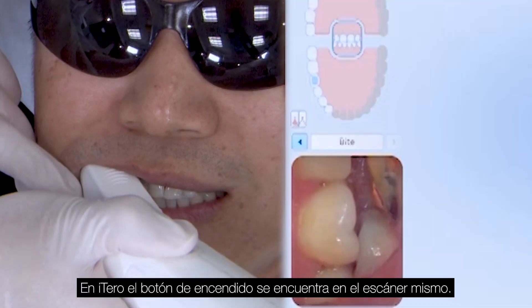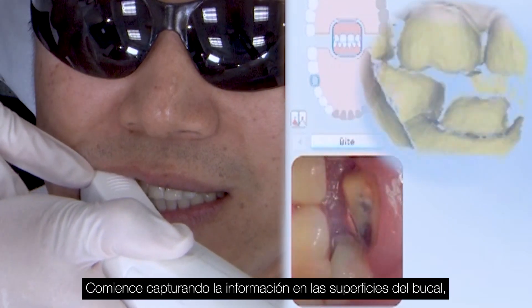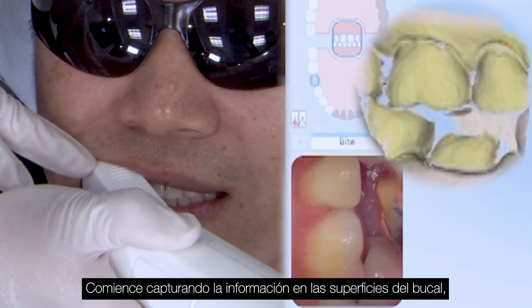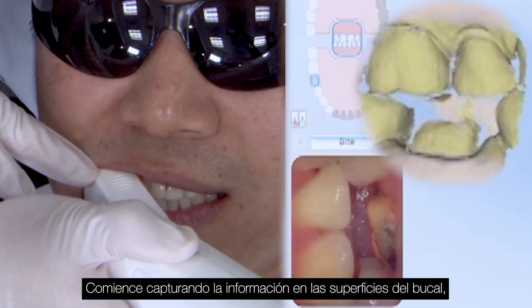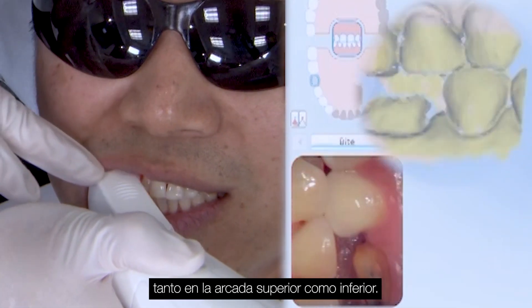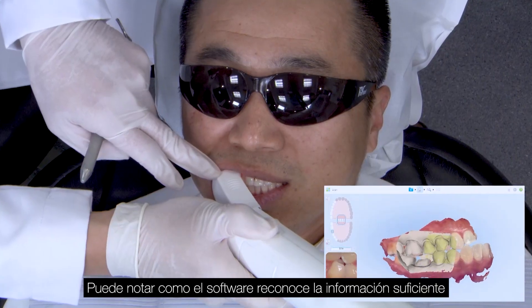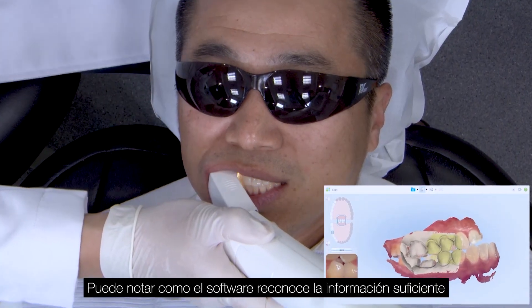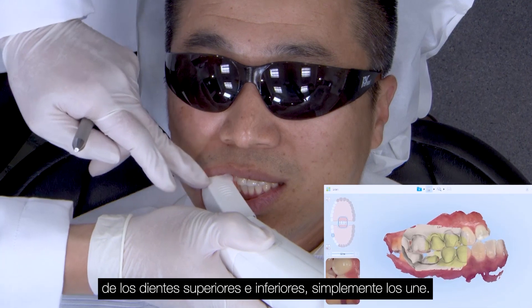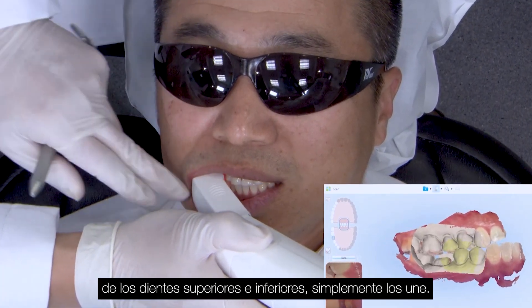I activate the camera here — with the iTero, the activation is on the scanner itself. I activate the camera and begin capturing information on the buccal surfaces on both the upper and lower. You can see once the software recognizes enough data from the upper and lower teeth it just brings those together.